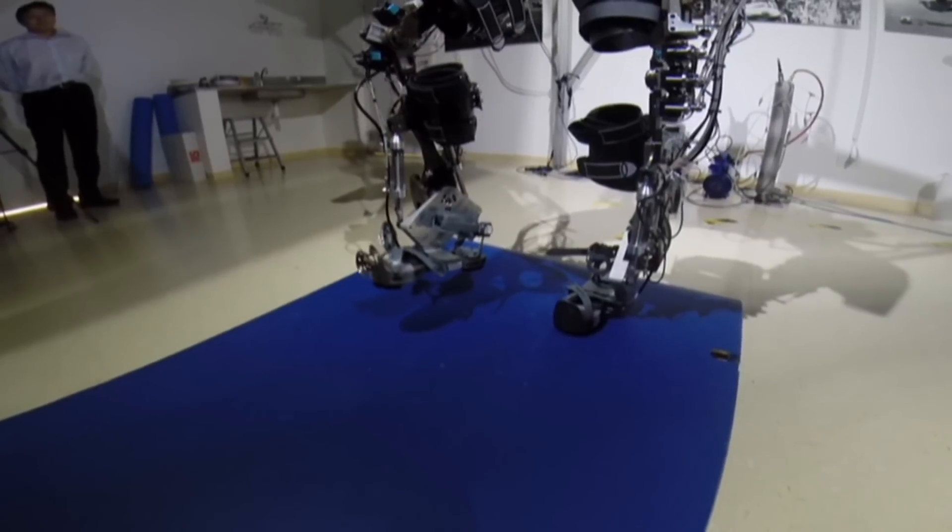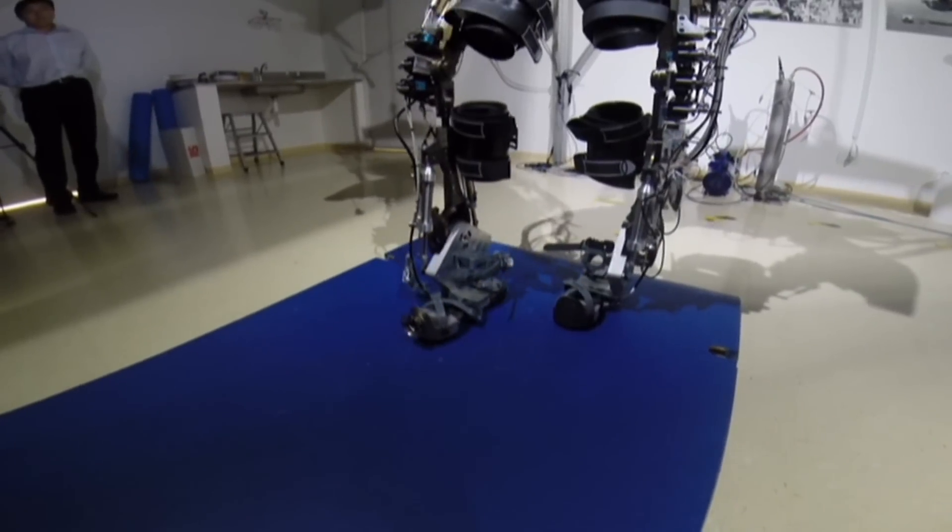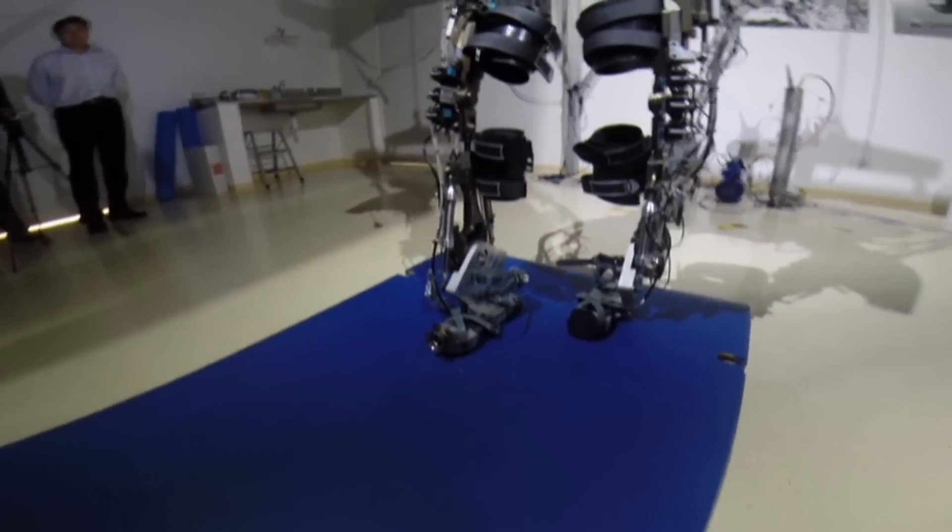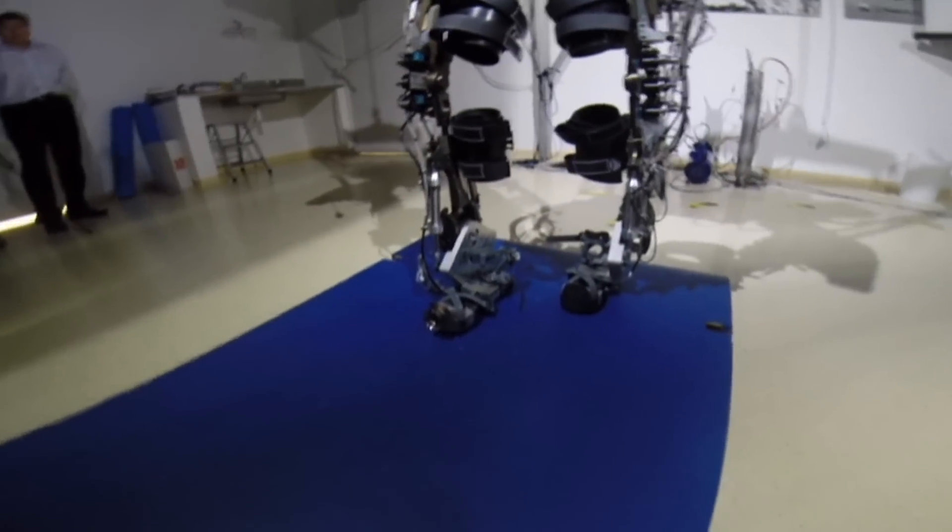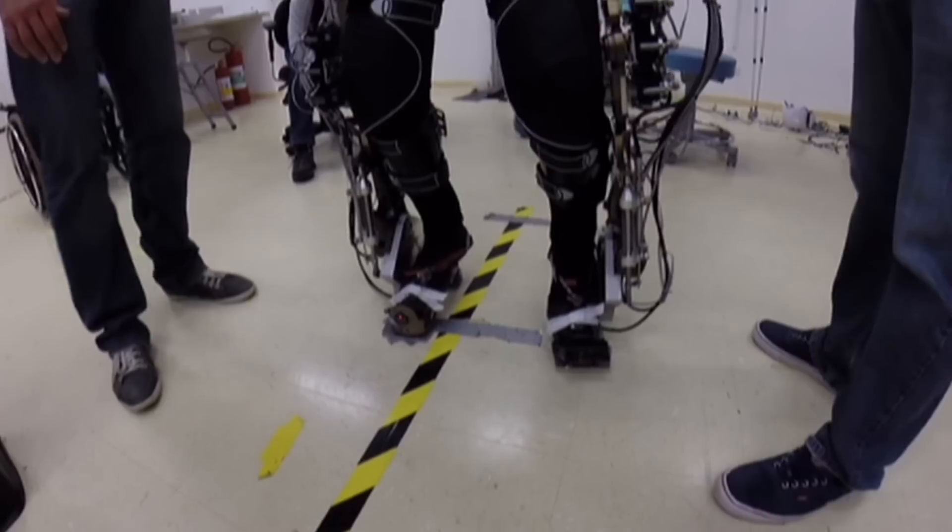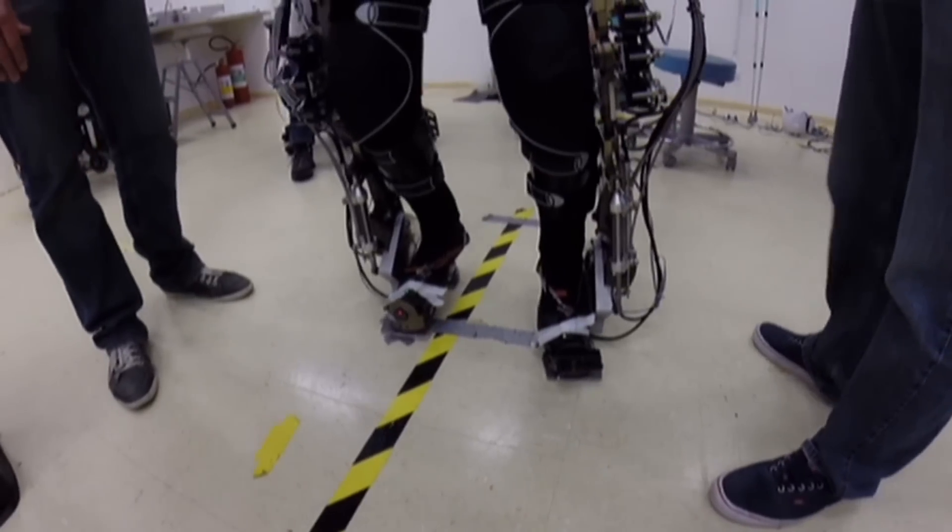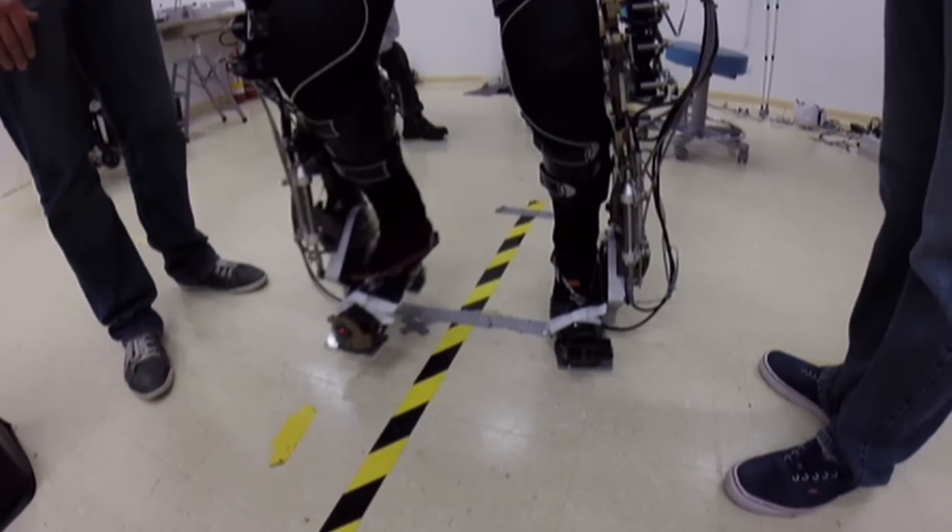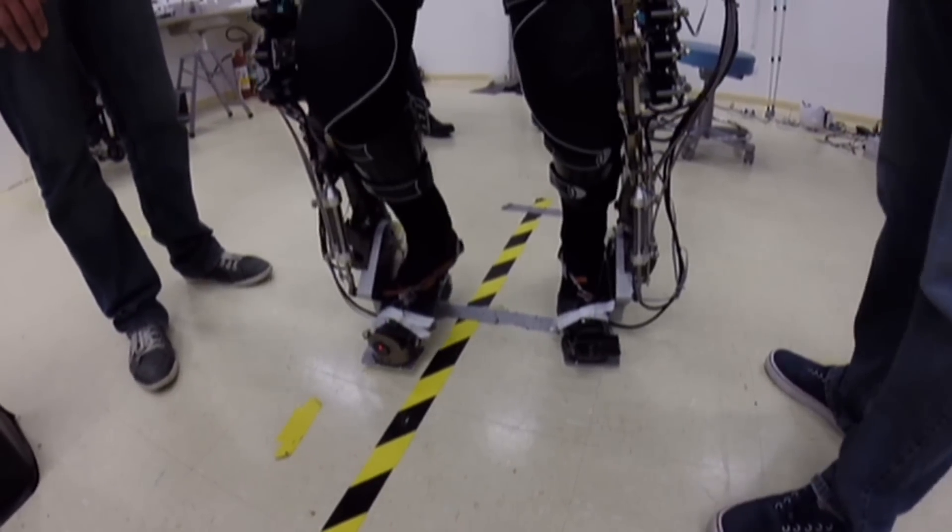For a moment, the world will catch just a glimpse of the potential for how this research and technology could transform lives.